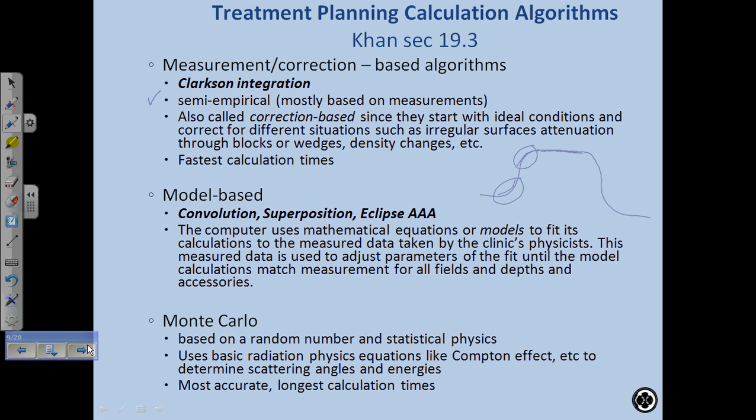The next type is model-based algorithms. Those are the ones that we're most familiar with, and the ones that you'll hear are convolution, superposition, and Eclipse AAA. The computer uses mathematical equations or models to fit its calculations to the measured data that you've taken. Now, all this requires you to take measured data.